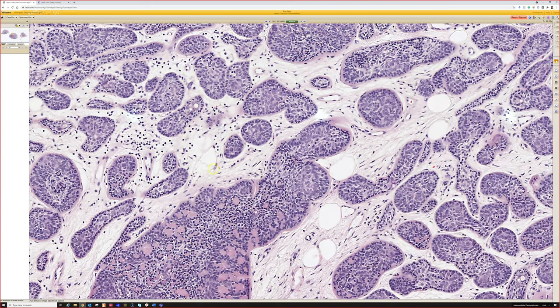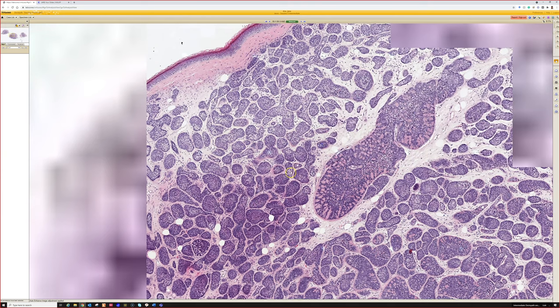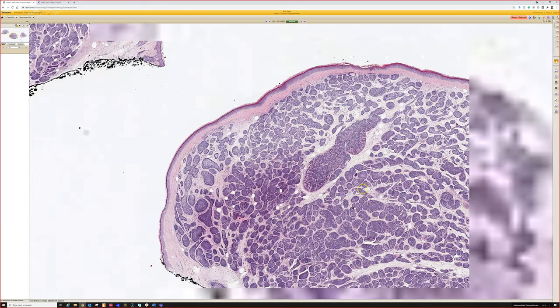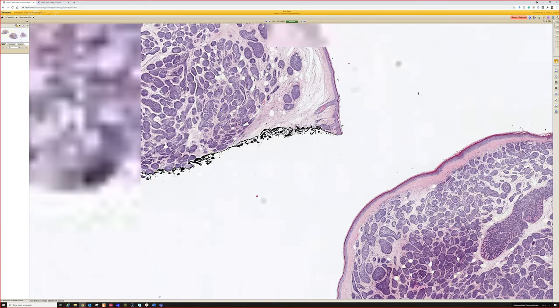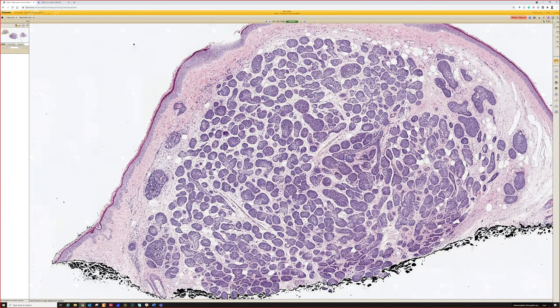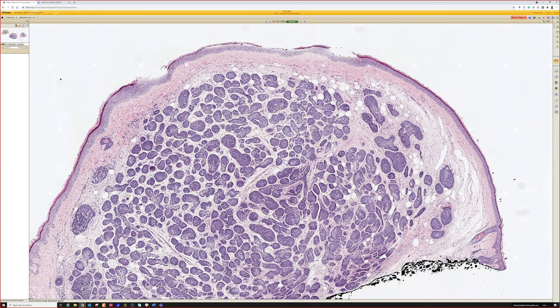And then also look at the stroma here. It's got a lot of very pale edema. You often have a lot of edema around cylindromas and spiradenomas. And again, these are related, and oftentimes you'll see an area that has cylindroma and spiradenoma, like a hybrid tumor. Okay, so that's a very nice example of a cylindroma, and of course these can be seen sporadically, but also in certain syndromes like Brooke-Spiegler.